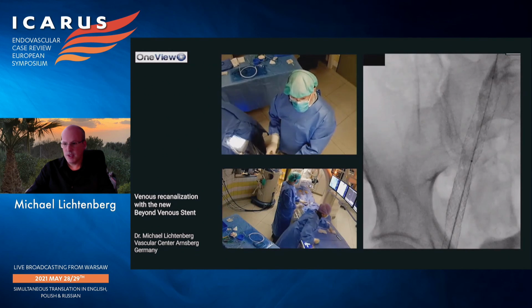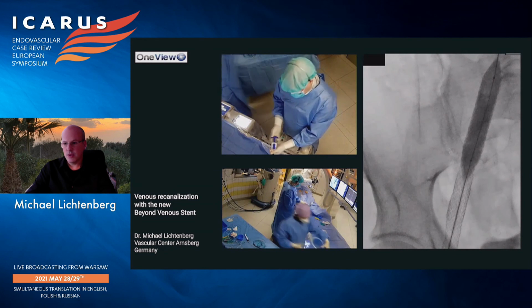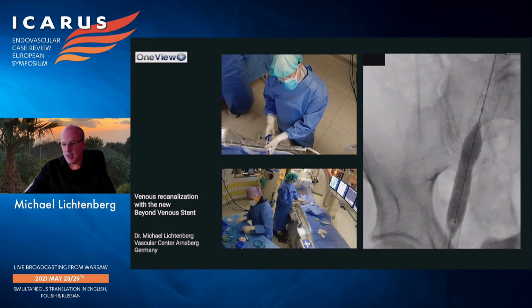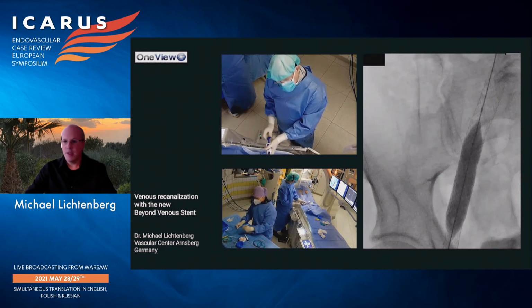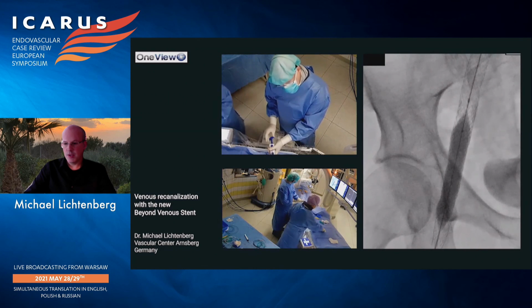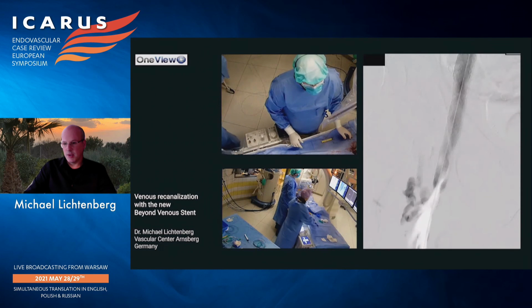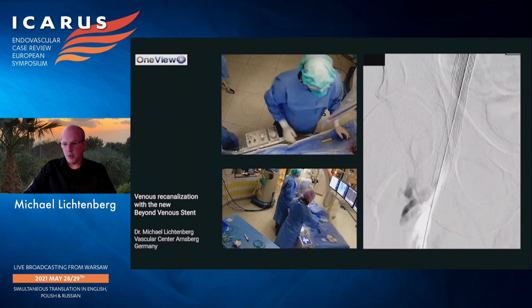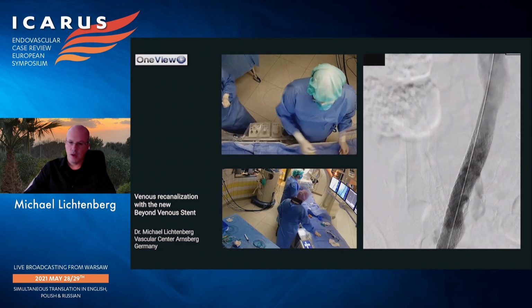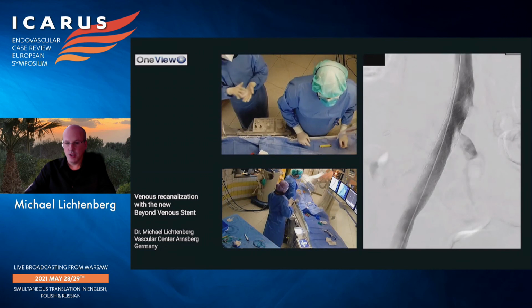Yeah, and after that, of course, intensive balloon angioplasty, as you could see here, with a 14 millimeter Atlas Gold balloon proximal, 12 millimeter balloon distal. And with that, you can really nicely open the stent, which I personally believe is very important to do, this post-dilatation. Otherwise, you create an artificial outflow obstruction. Yeah, and here also you could see that there was a very good inflow after 2-3 heart cycles, and outflow, no persisting of the contrast, going up directly with the injection.